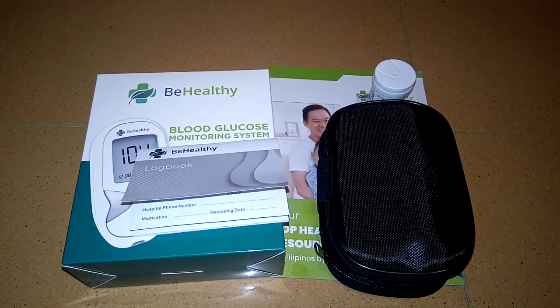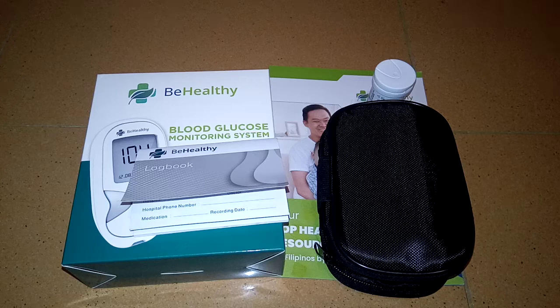Hello everyone, this is Zee from The Caregiver Search. Today's video I will show you how to use this blood glucose monitoring machine from Be Healthy Philippines. They sent me this set just to try their product, and I already tested it on my client, my neighbors who are diabetic, and my mom. I'm very satisfied with this product and I definitely recommend it.